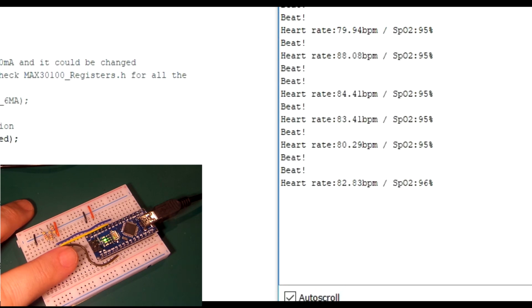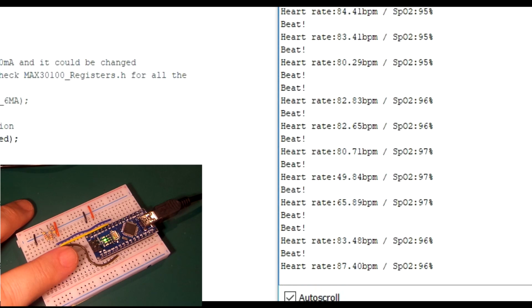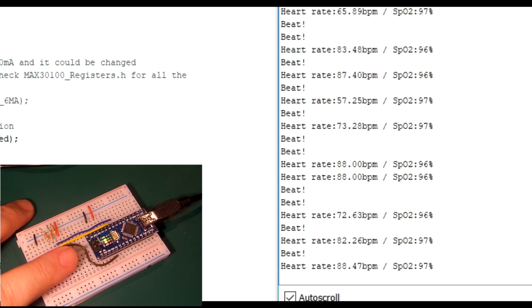So my heart rate is around 80, which is average for me. And with a blood oxygen level of 96/97 coming out there, which is actually, I was in hospital fairly recently. And yeah, I was around about 97 or so for my blood oxygen level.